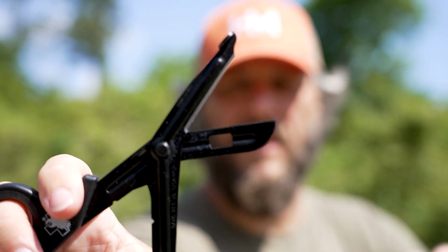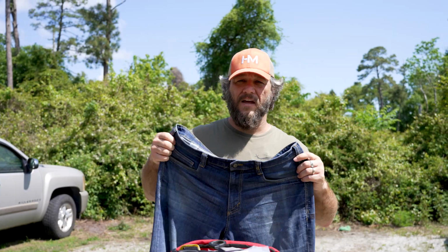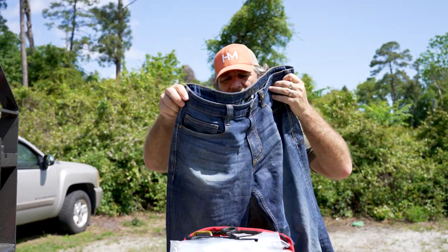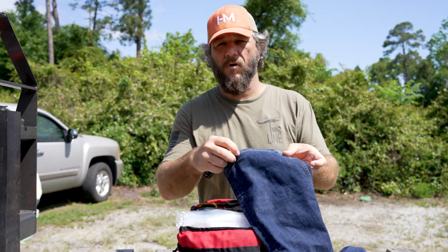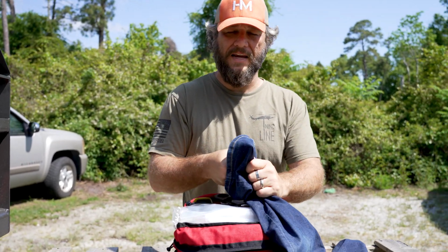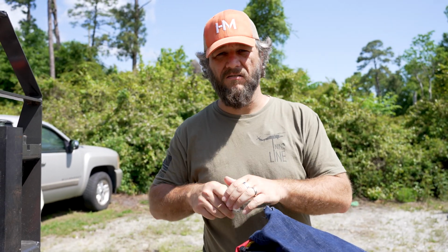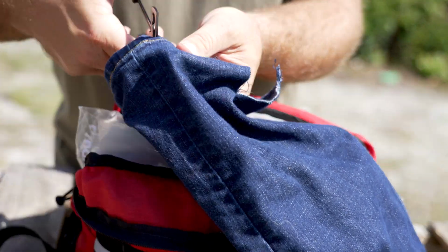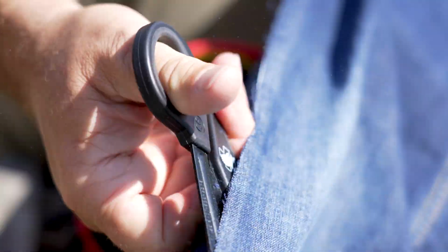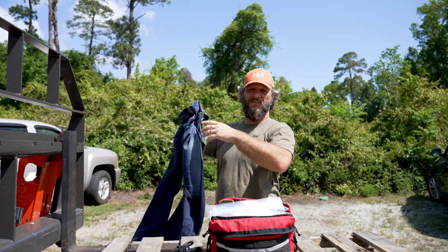You've probably seen doctors on TV, maybe even doctors in real life using these. Let me show you what they are good for. So let's say you've got an injury underneath your jeans, okay? And these jeans right here, what are these? Oh, you know what? These are from the last time I went to Taco Bell. I've had to do this before. Somebody has an injury, you open up your knife and try to cut away to get to the injury. Highly unsafe, because you could jab the person you're trying to help. So the trauma shears are really good for that right there. I'm going to save these. Maybe a nice pair of cutoff shorts for the summer.